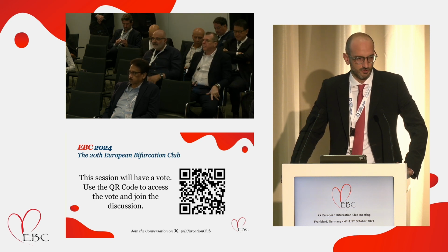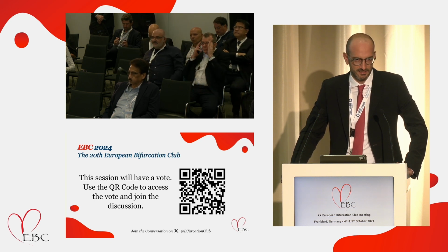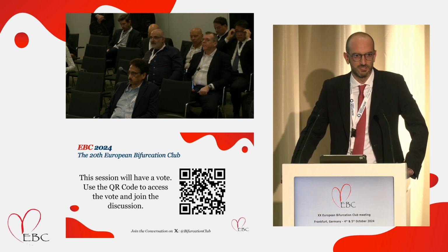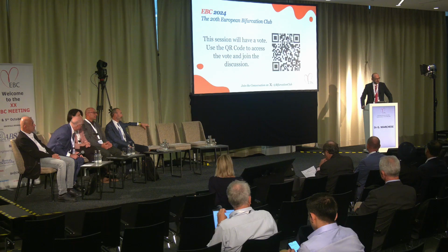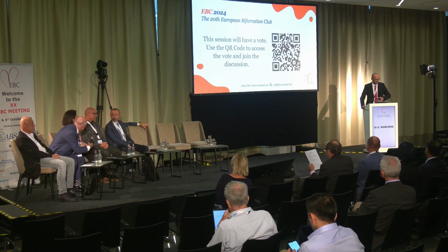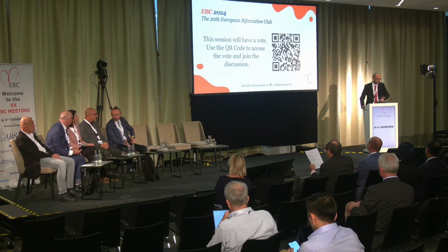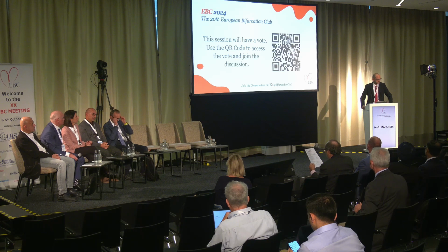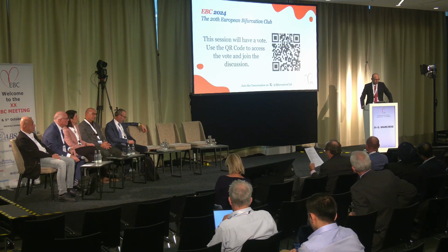Thank you very much for your comment. You're absolutely right, and we are methodical with respect to the hybrid CTO approach. But in this case, which I didn't show you, there was really poor collateralization from the right, so that's why we didn't take another catheter. That would have been very easy. It could be a 5 French diagnostic, but it was not useful.